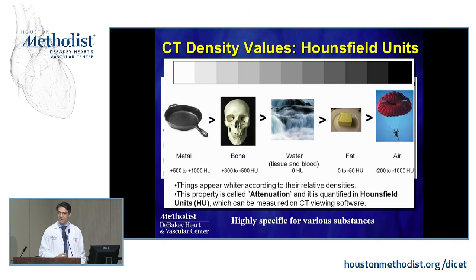Air generally has Hounsfield units around -1000. Fat is also in the minuses, usually up to around -100. Water, which the Hounsfield units were calibrated to, is 0. Bone is around 300 to 500, and metal is much more positive, usually in the 1000s. So Hounsfield units tell us how much the X-ray beam is attenuated when it hits that object.